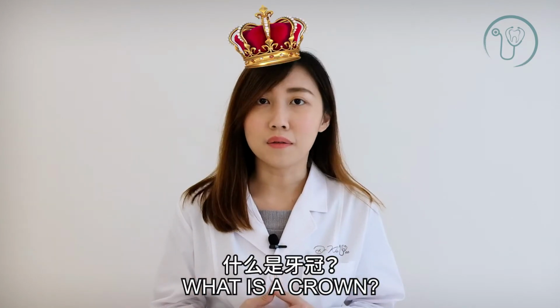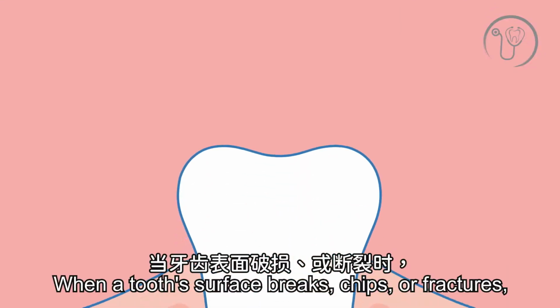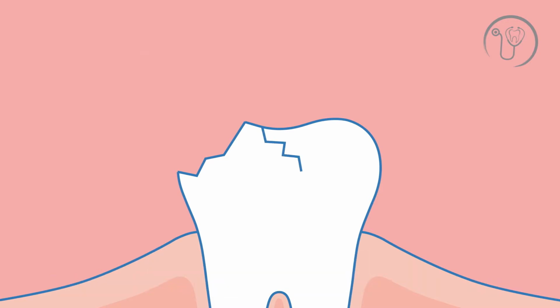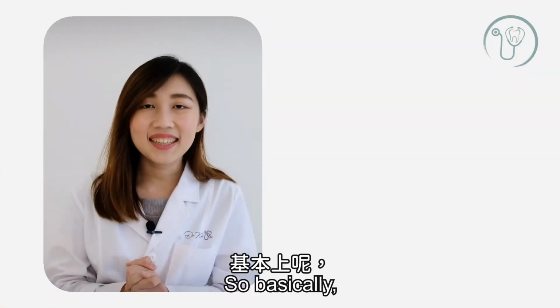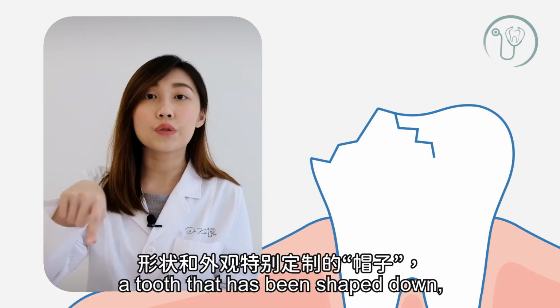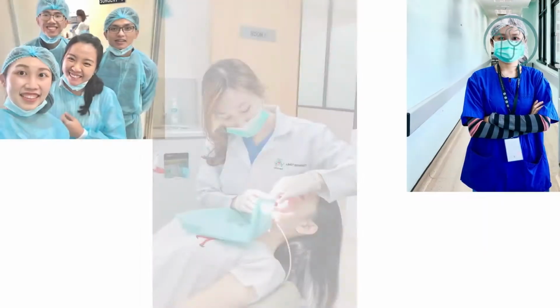What is a crown? In dentistry, a crown is the surface of the tooth that is covered by enamel. So when a tooth surface breaks, chips, or fractures, then an artificial dental crown will need to be placed to prevent further damage. So basically, a dental crown is a cap that has been customized to be placed over the tooth that has been shaped down in order to restore its natural look, function, and shape.